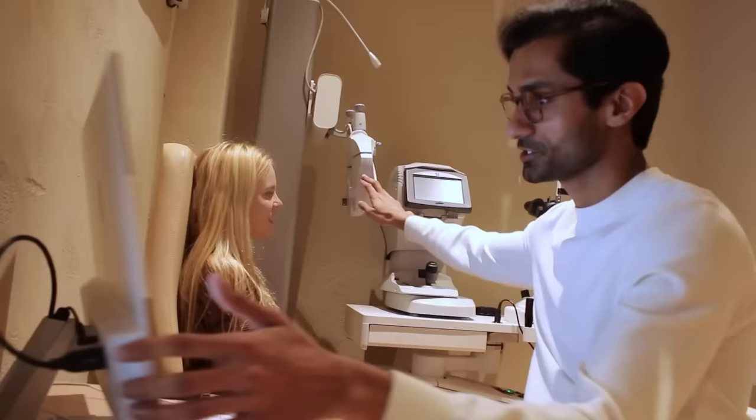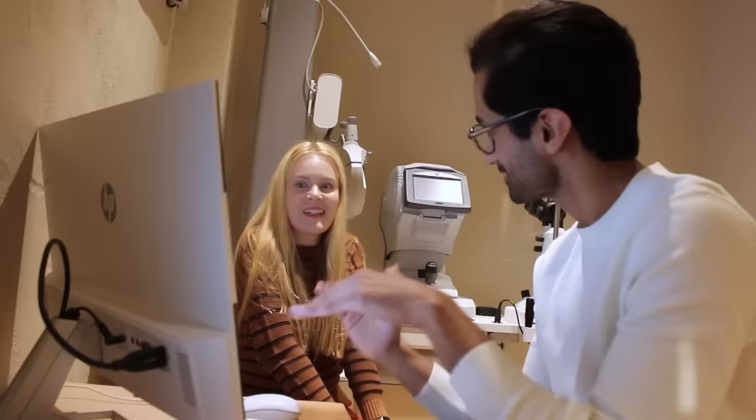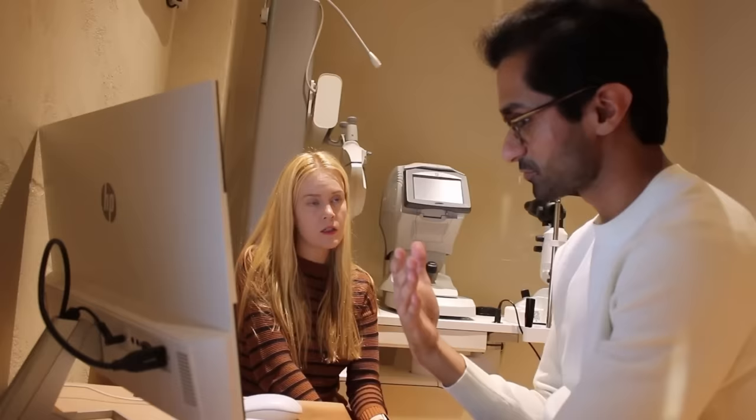Has anyone explained these numbers to you before? You may have seen them before. Yeah, I know the minus one thing, but I don't really know the details about what they mean. I'll run through it. I found it a little bit different today on the left eye, -1.25, so maybe it's crept up slightly. Basically, when it's a minus, it means you're short-sighted: farther away things are a little bit blurry, up close you can actually see pretty well without anything at all. Kind of what you already thought, right?